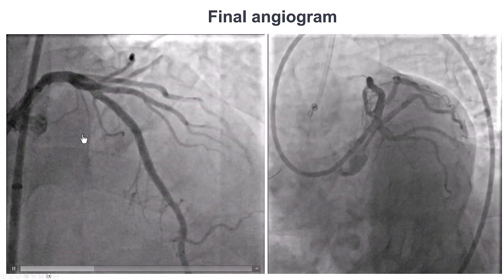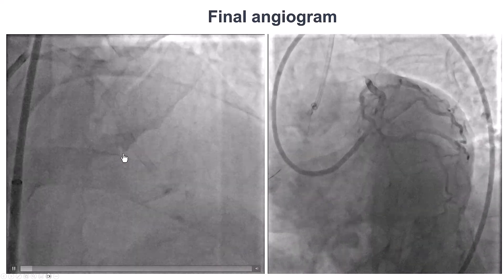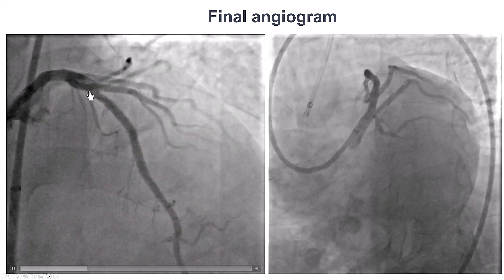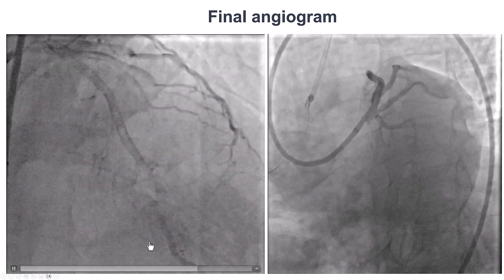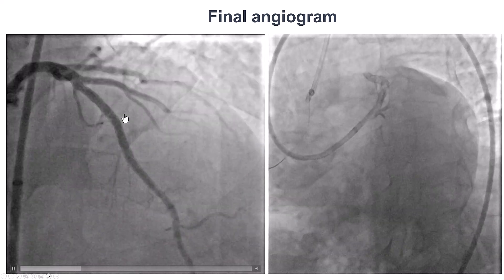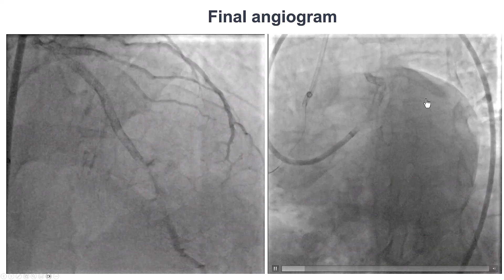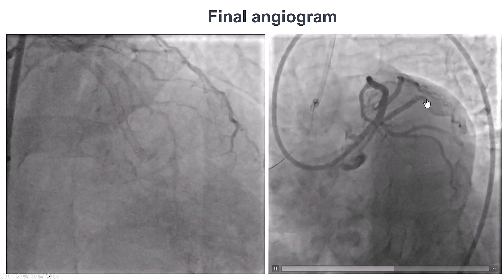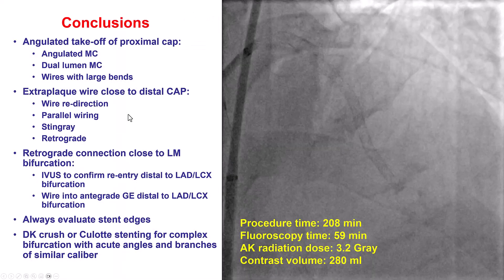This was the final result, with nice flow into the LAD. We have preservation of the septal branches and an excellent result also in the diagonal branch. This was confirmed using intravascular imaging.